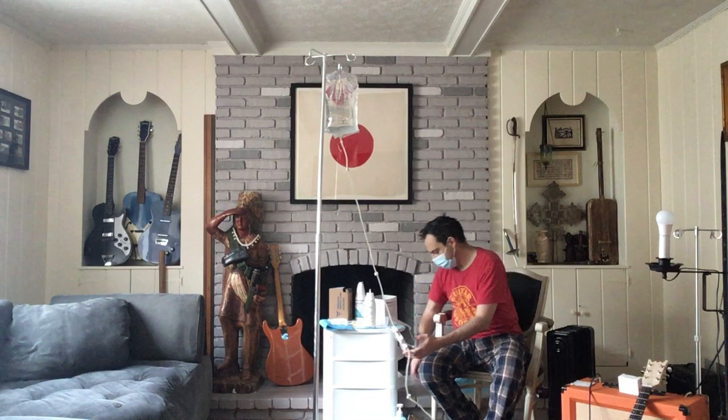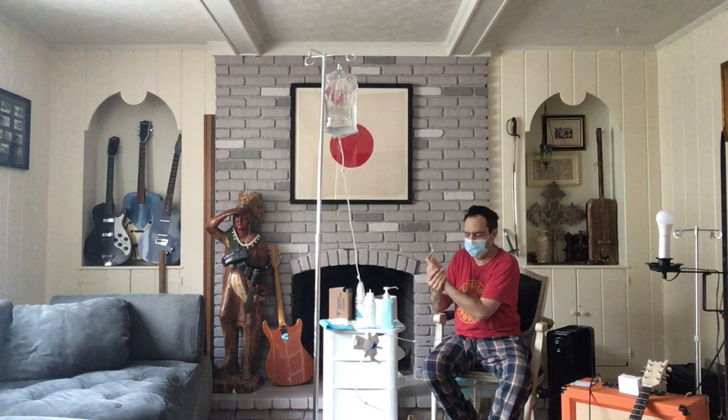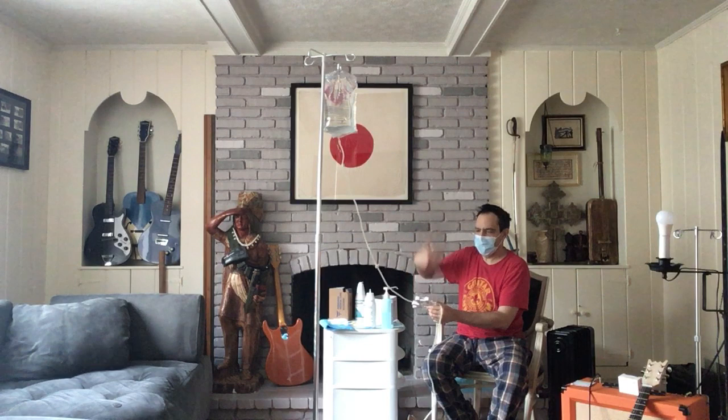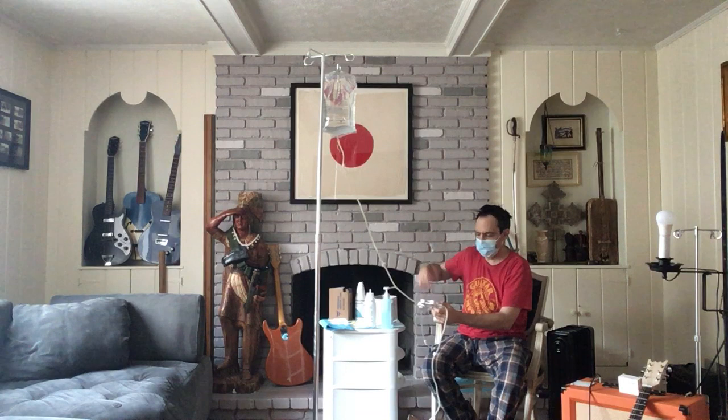Let's go ahead and spray your hands again, because this is really the moment of truth. If any part of this right here goes wrong, if anything gets into it, it could cause serious infection. You could end up in the hospital. It would hurt for a week, and you would pray for mercy.